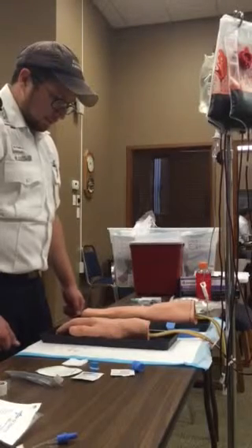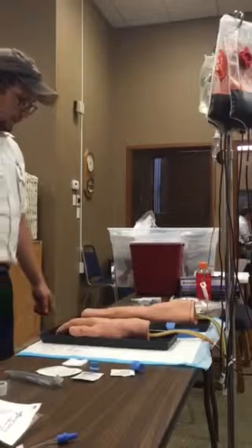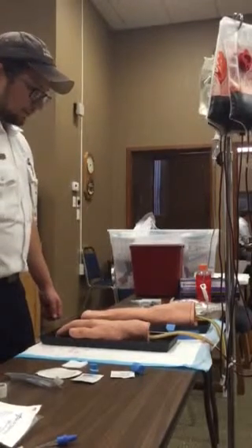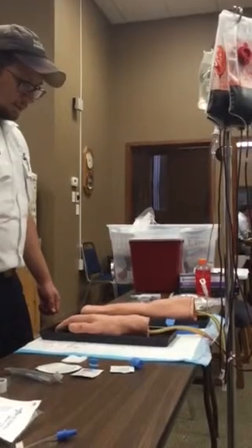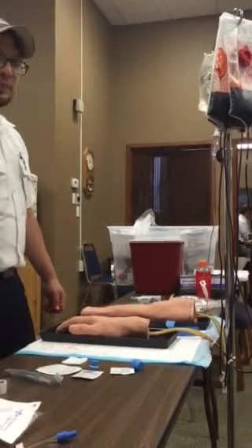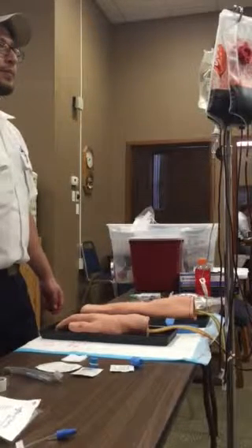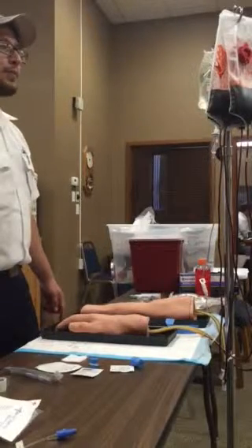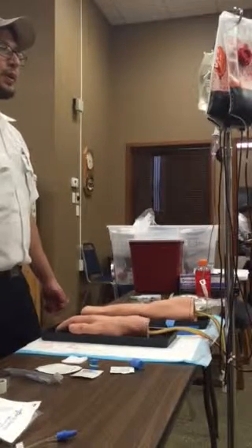You will have 3 attempts in a 6-minute time limit to establish the IV. If you do not successfully establish an IV, you'll be unable to administer the IV bolus of medication to the patient. Although you're using a mannequin arm, you should conduct yourself as if this were a real patient. You should assume I'm the actual patient and I may ask any questions you would normally ask a patient in this situation. After you establish the IV, you will have 3 minutes to begin IV administration of the bolus of this medication. Do you have any questions about the scenario or your equipment?